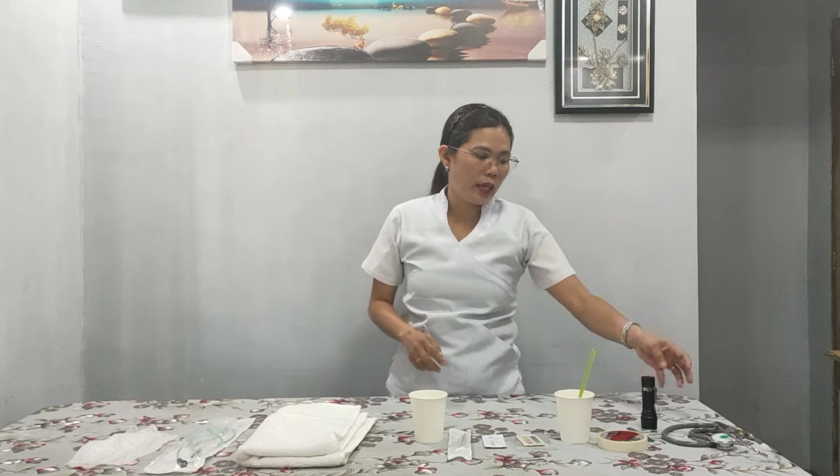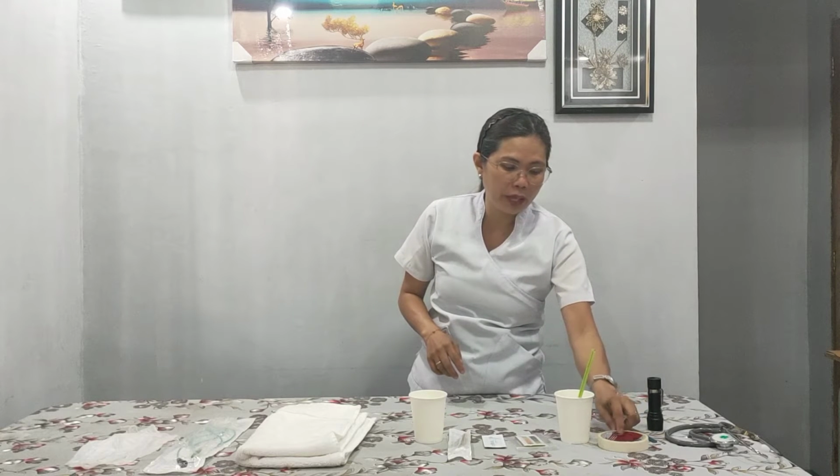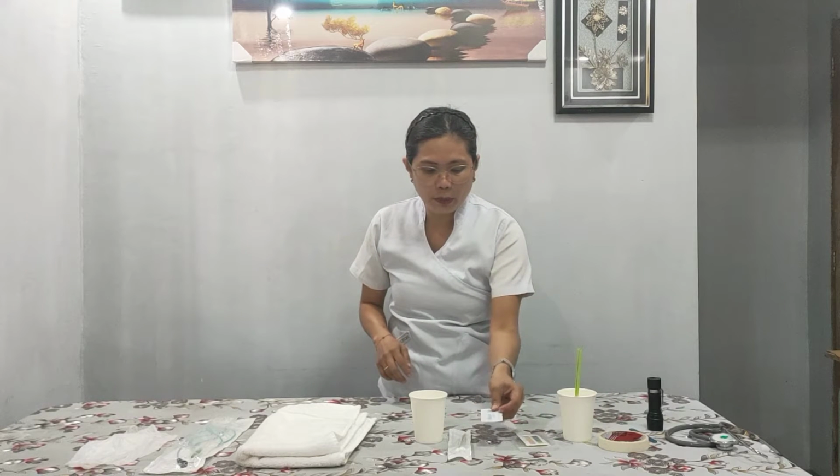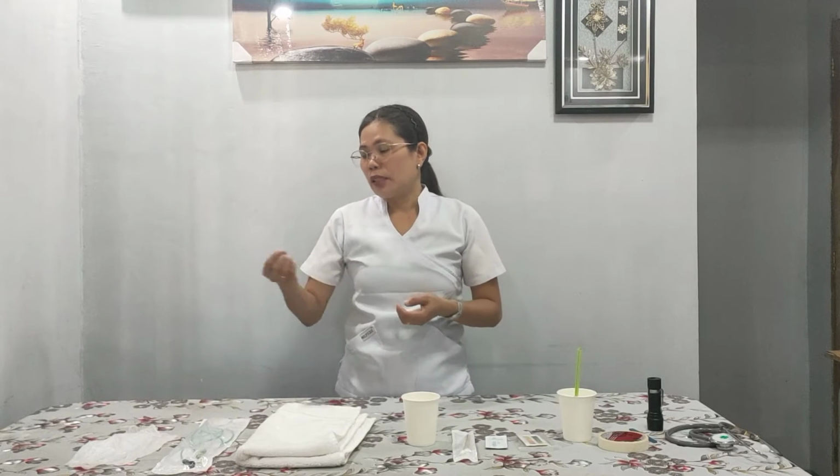These are the equipment that I am going to use: the stethoscope, the pen light, the tongue blade, the improvised micropore tape, a cup of water with straw, pH strips, water-soluble lubricant, cotton balls, specimen cup, pad or a towel, the nasogastric tube that is appropriate to the size of our client, and the disposable gloves.